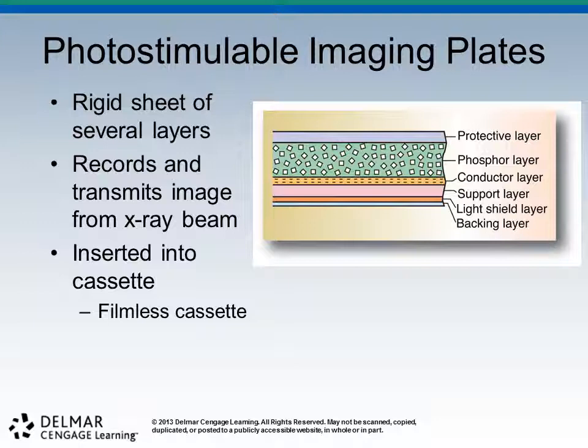That's something you probably have covered in the ASRT module. We call these a filmless cassette because indeed there is no film. There is just that white board that I pulled out and showed you in class the other day. And notice, it's not sensitive to room light. It's much more sensitive to very bright light, but room light tends to not even transmit anything to it.